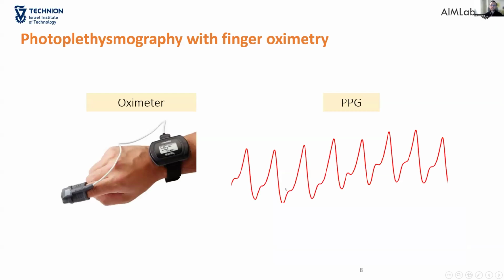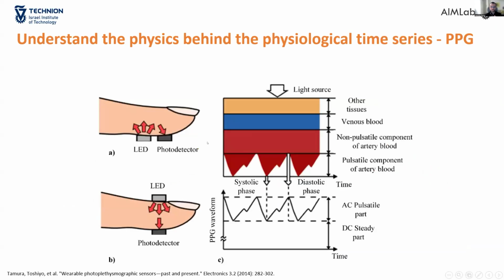With that, I'm transitioning to PPG. I will give some introductory words here. This introduction may be repetitive for those of you who are already familiar with what PPG is, but it's necessary for those who are not. Often, PPG is associated with pulse oximetry. The reason is that pulse oximeters are based on PPG measurements. This is the raw signal that they measure.